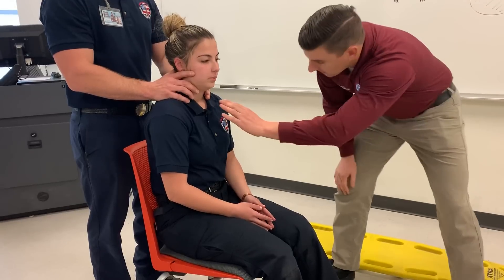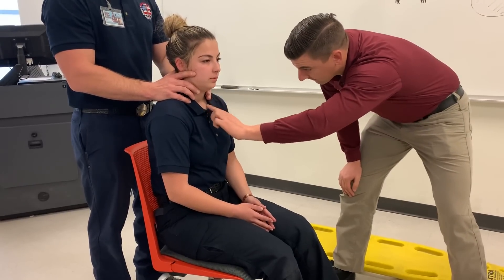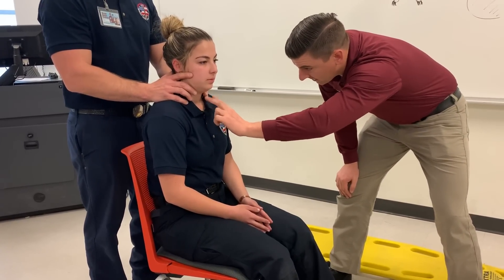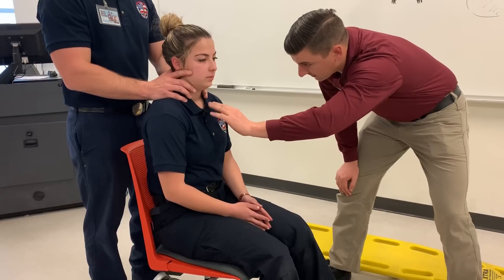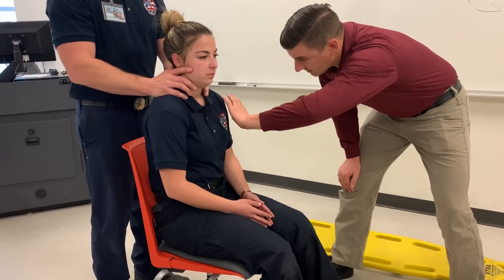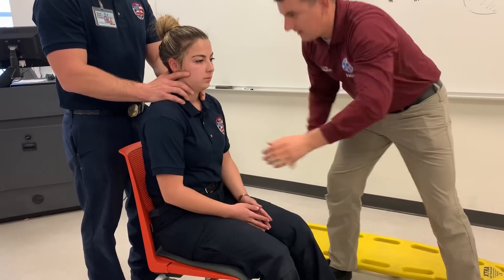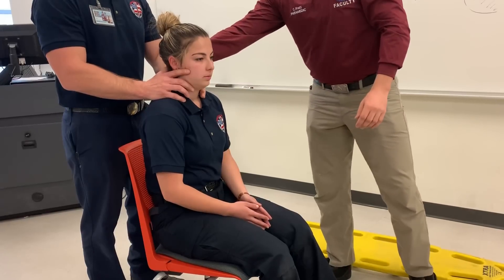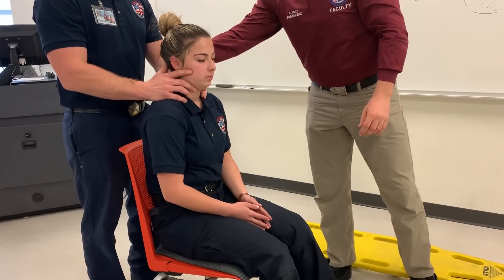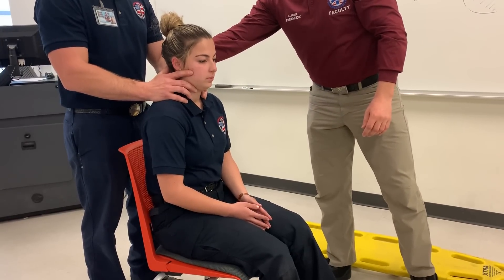Going to the neck, observing for DCAP-BTLS, looking for tracheal deviation, jugular vein distension, stoma, medical alert tags, and subcutaneous emphysema. Also palpating the back of the neck for any step-off, point tenderness, and blood on glove.